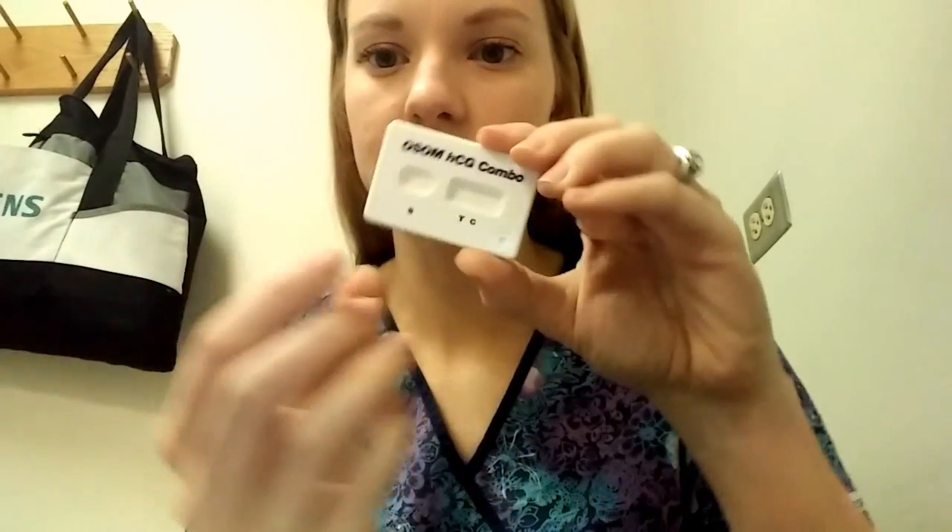When your serum is added to the sample well using the pipette provided, the sample migrates through reaction pads. If HCG is present in the sample — in the blood or serum — it binds to a monoclonal anti-HCG dye conjugate. So HCG binds to anti-HCG — that's the antibody. Then the sample migrates, picking it up and moving along like a little conveyor belt, across the membrane towards the result window.